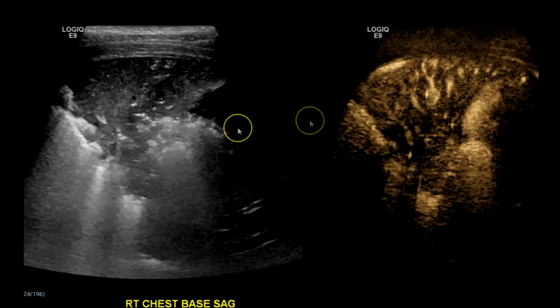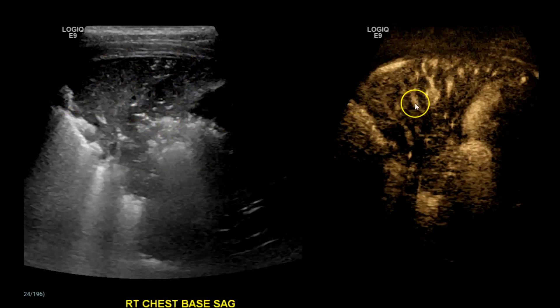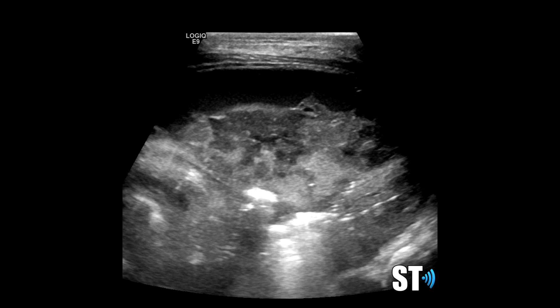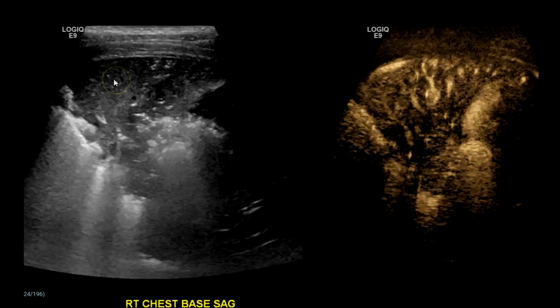And here's a side-by-side with B-flow of the lower lung with consolidation. You can see the vascularity with the B-flow. Now remember, consolidation is just fluid within the lung tissue — the alveoli fill with fluid. They can also fill with pus. You can have hypoechoic areas, which can be necrosis or infarction or abscesses.